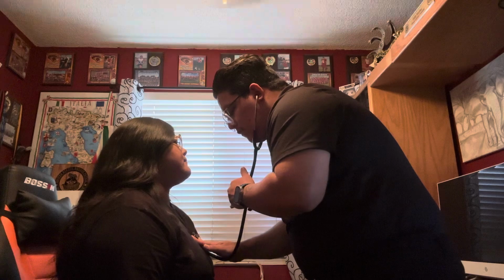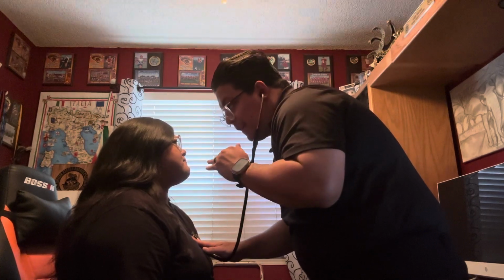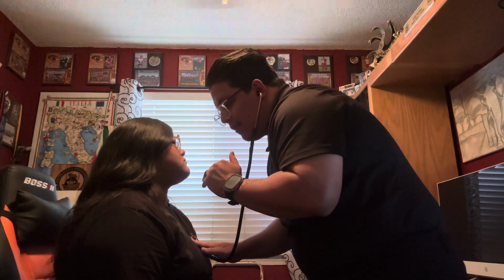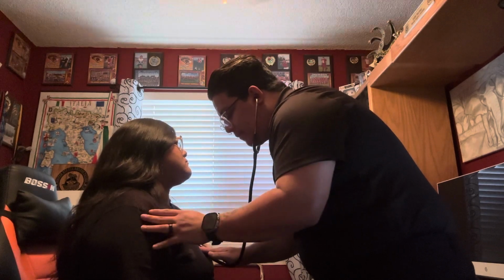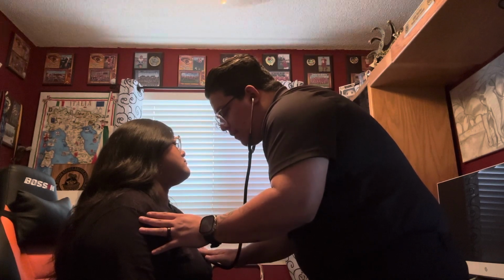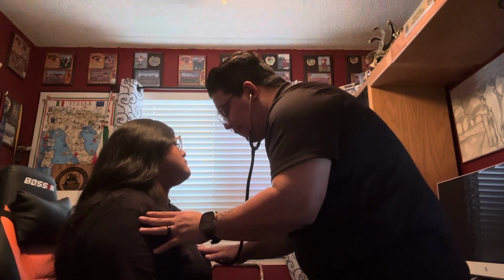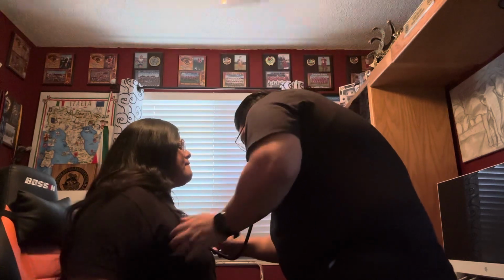Now, directly across is going to be the pulmonic. Beautiful pulmonic. S1 and S2 is notable here. You can hear the valves opening and closing, going down to Erb's point. Okay, perfect. Now, right under Erb's point is going to be the tricuspid. That's the one that you're going to go ahead and listen to. So from Erb's point, we'll just go ahead and go down.